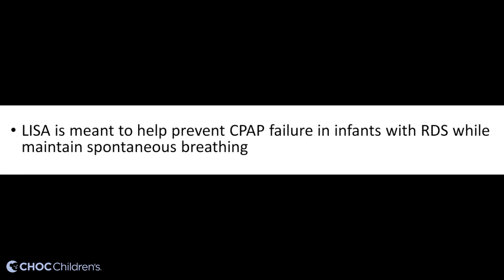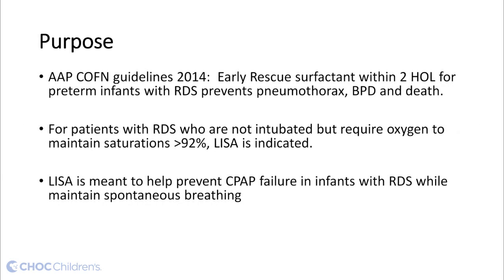The purpose of less invasive surfactant administration is to prevent CPAP failure in infants with RDS by providing surfactant therapy in these patients while maintaining spontaneous breathing without requiring intubation and mechanical ventilation. This procedure is performed by placing a thin catheter below the vocal cords using a laryngoscope to administer surfactant into the lungs.